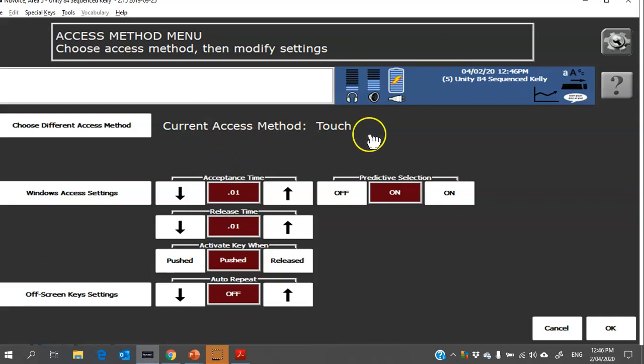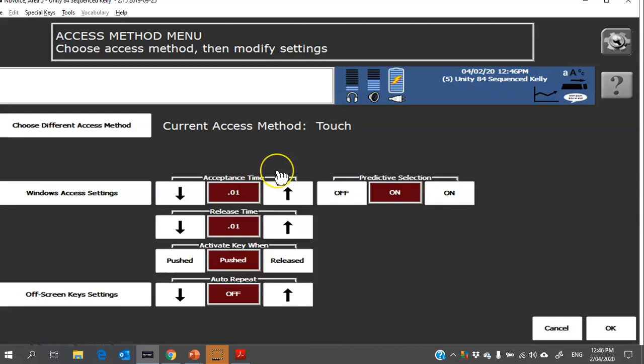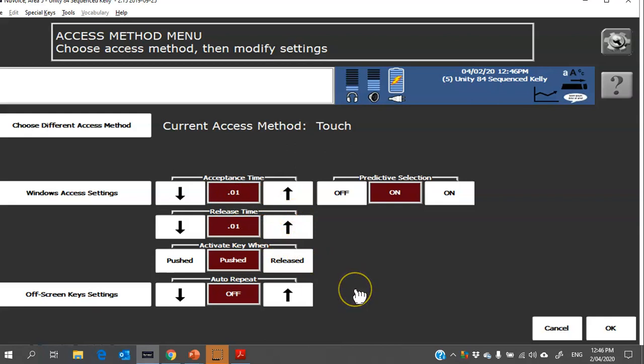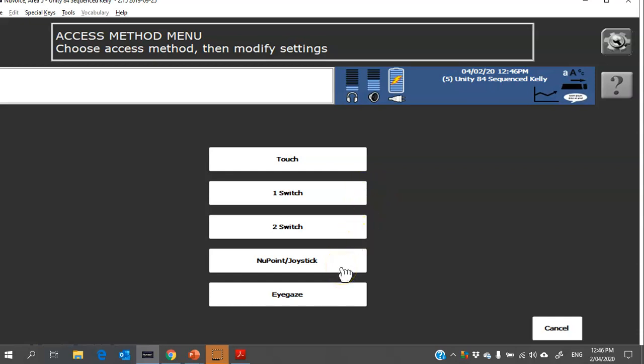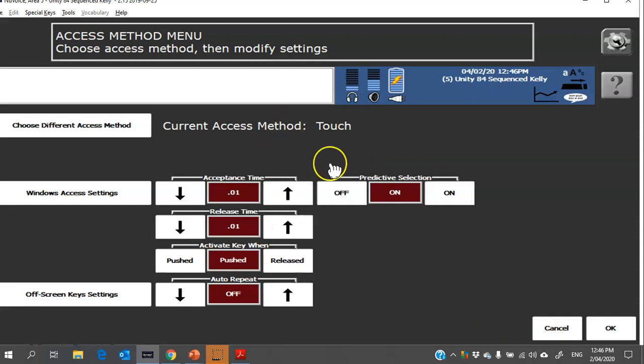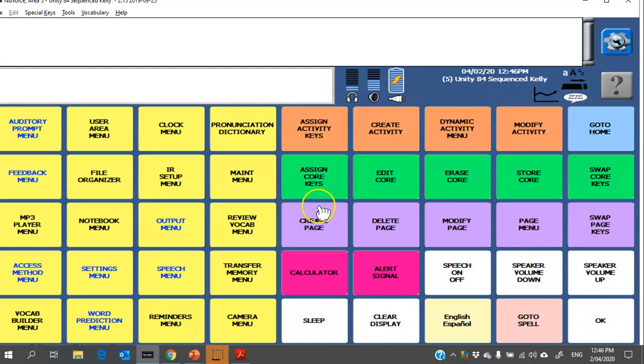You can see at the moment it's set on touchscreen and there are some settings down here: acceptance time, how long the person has to hold each cell for it to activate; release time, how long they have to have their finger off before it activates another button. These settings can be changed depending on the person's fine motor skills and needs. If you need to choose a different access method, that button's just up here and this is where you can change the device to be activated by one switch, two switch, NuPoint or joystick, or eye gaze. If you need more information about these access methods, please don't hesitate to contact us. So I'm happy with touch and the standard settings that are there, so I'm going to click OK.